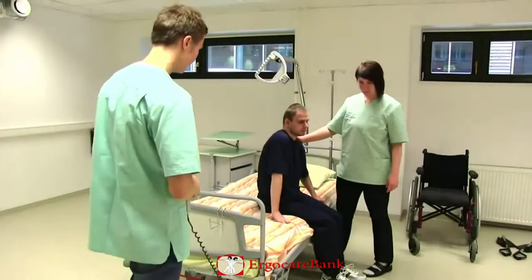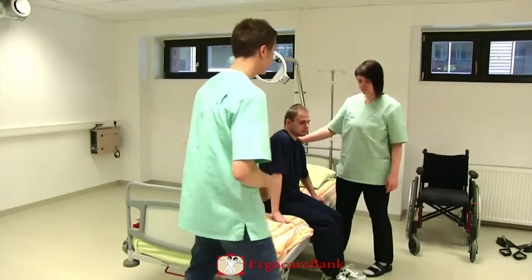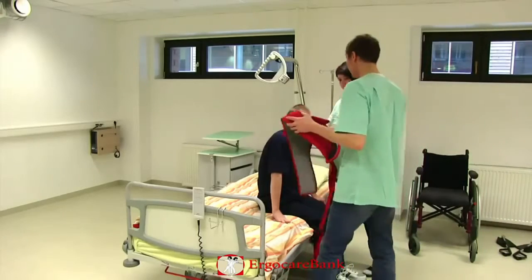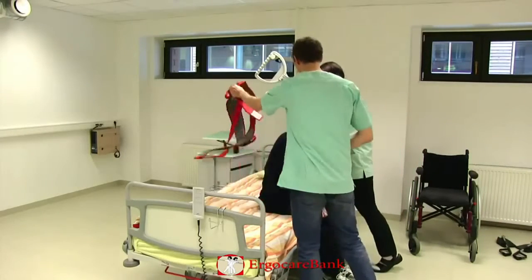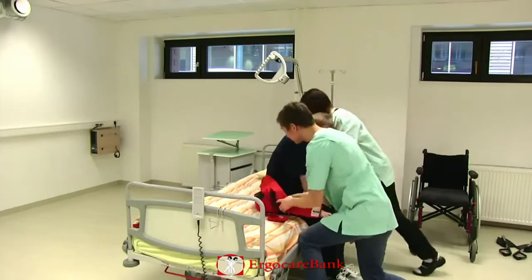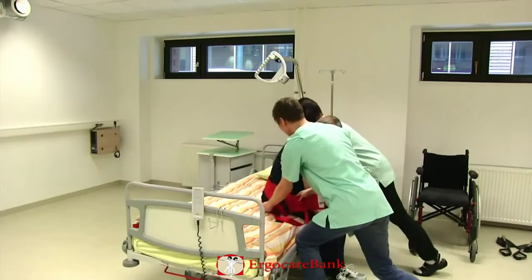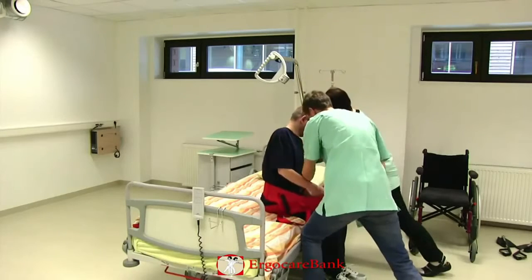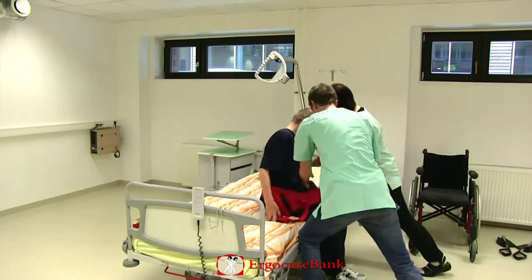Charlie is moving from his bed to the wheelchair. He's not feeling good today and therefore needs the assistance of two people. The staff are using the return to assist Charlie to get off the bed. They start by raising the bed and putting the belt around his buttocks and hips.